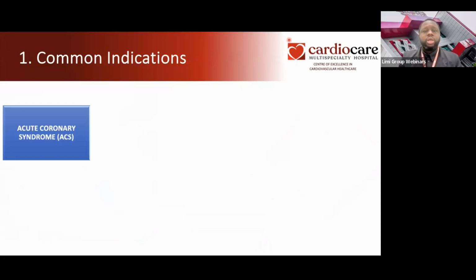Patient presenting with ongoing chest pain. Somebody's asking, where does CT coronary angio come in the diagnosis? So I'll talk about that down the line. So just hold on. What I'm talking about now is the invasive coronary angio, not CT.